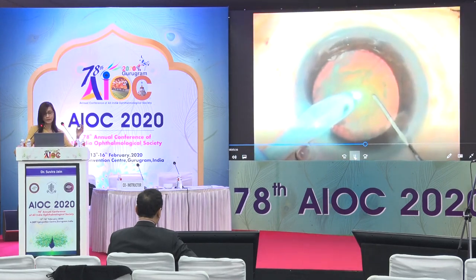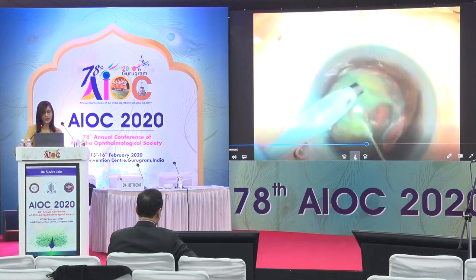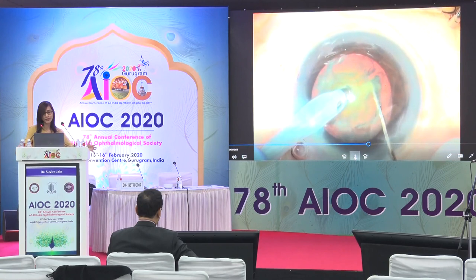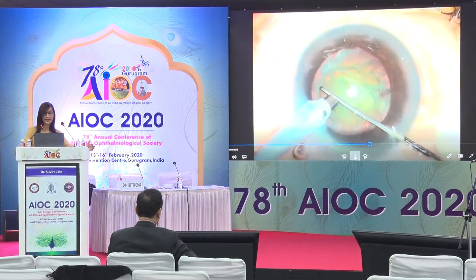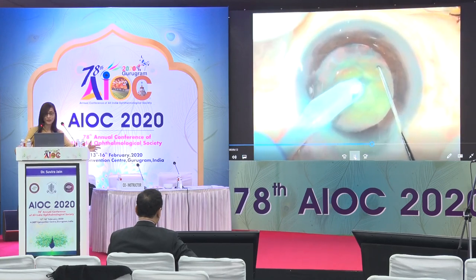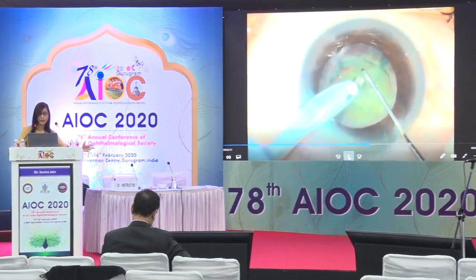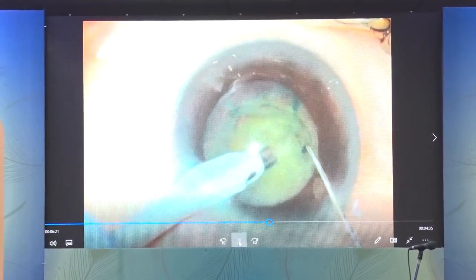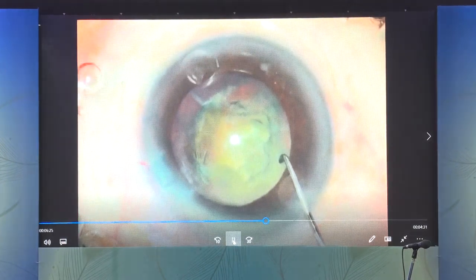When doing a direct horizontal chop, especially for slightly harder cataracts, you never have such a wide lateral separation. In this case, the surgeon has such a wide lateral separation and actually yanks the nucleus around — which would otherwise be safe in a normal cataract — then performs the second chop. When he attempts to rotate the nucleus for the third chop, he notices those maneuvers have resulted in opening of the posterior capsule.